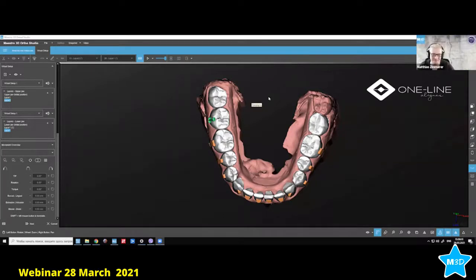Yes, this is the right one. This is the right way. So I'll see the feel, and I'll see the pressure. I can see how it's going to work.